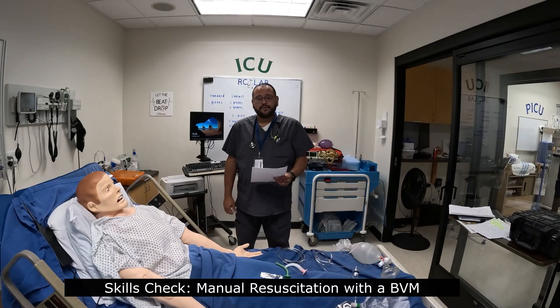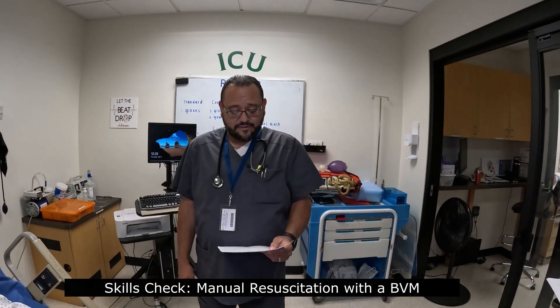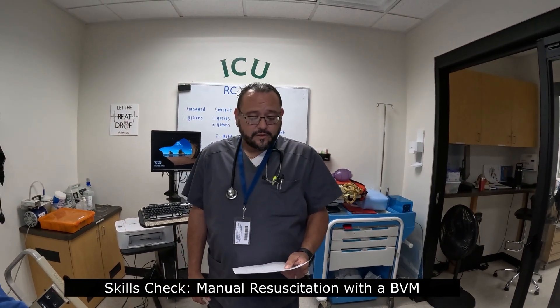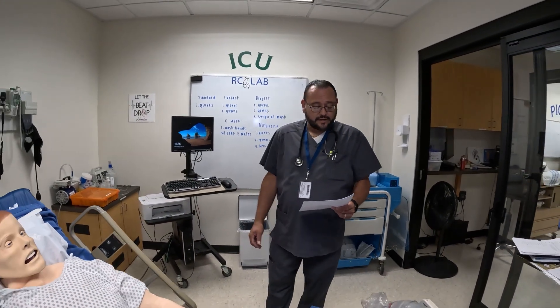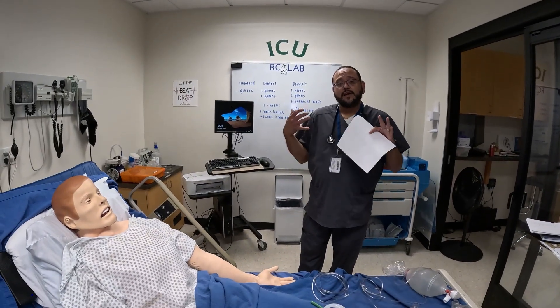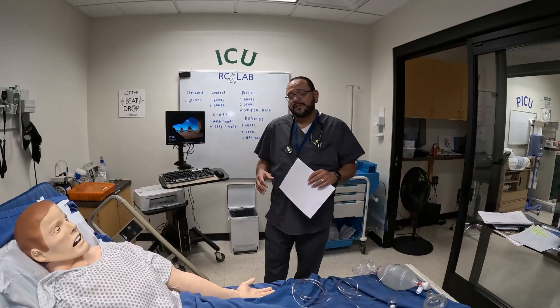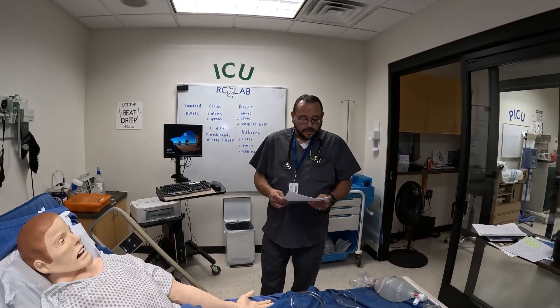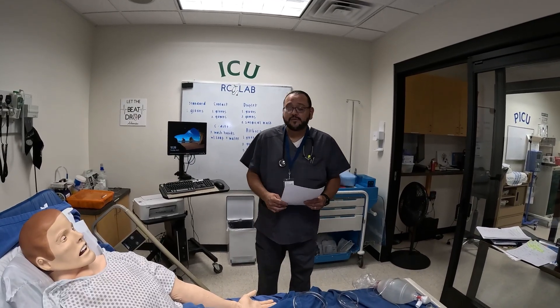Hello and welcome. Harvey Olivia with Carrington College, clinical instructor. We are going to do our competency for manual resuscitation. To start things off, we're going to observe standard precautions — make sure you've got gloves on, gown, protective eyewear, anything necessary based on your hospital's protocol. After putting on all PPE, we'll get the equipment.